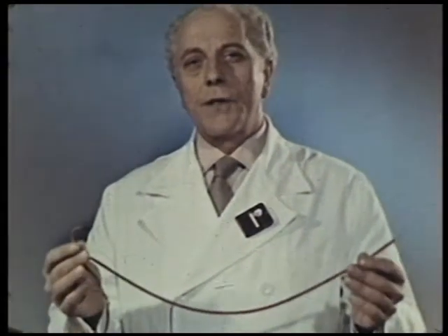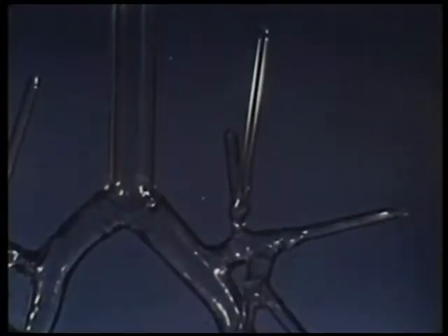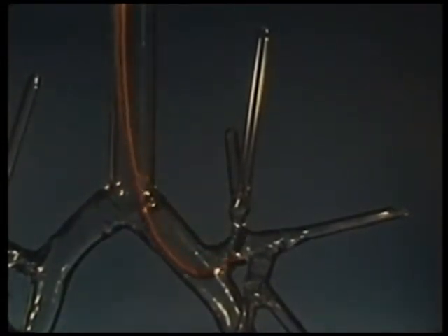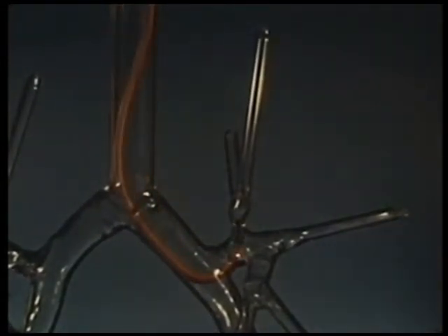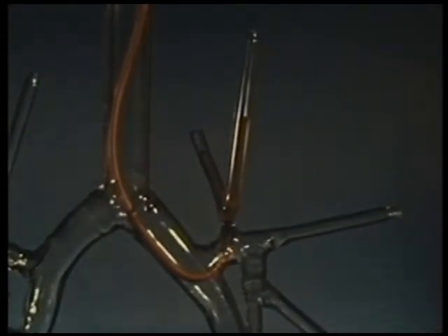For selective demonstration of the apical posterior segments of the left upper lobe, we use this special catheter. After passing the bifurcation, it traverses the left main bronchus and enters the upper lobe bronchus. The tip next enters the opening of the posterior bronchus and occludes it in its proximal part. The contrast medium is then injected, and this segment alone is then displayed.